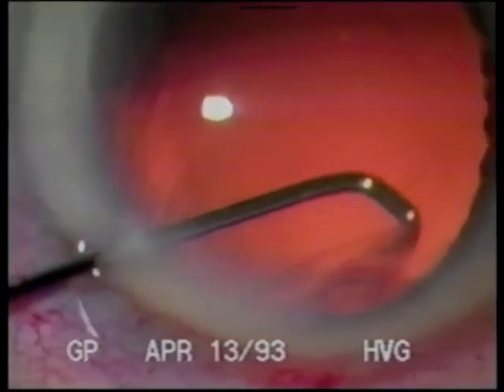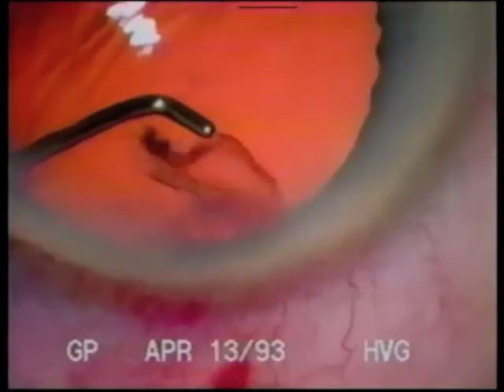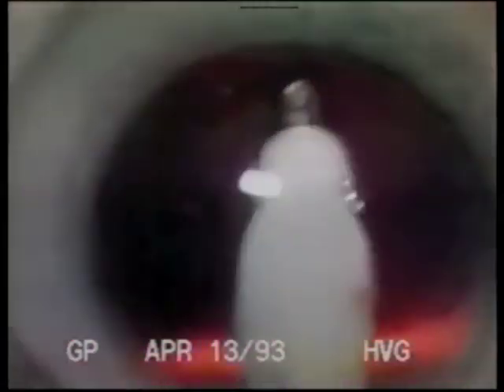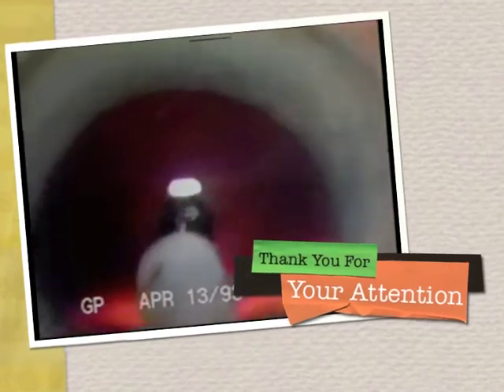Some cortical wisps are left behind when the fluid wave does not cleave right next to the capsule. I use the doubly bent 30-gauge cannula on a 3cc syringe for cortical cleanup in the capsule area under the incision. After phacoemulsification, if cortical cleaving hydrodissection has been used, the cortex comes along with the epinucleus and there is very little cortex remaining. If superior cortical cleaving hydrodissection is used, cortex in the 6 o'clock area that remains is easily engaged with the irrigation aspiration tip.